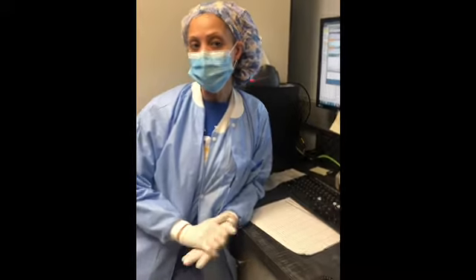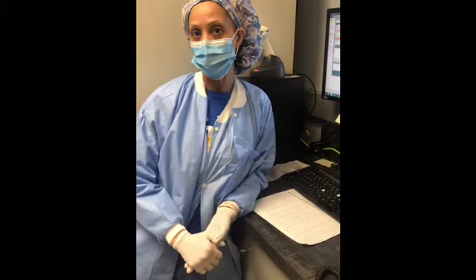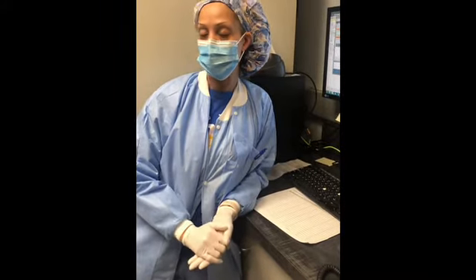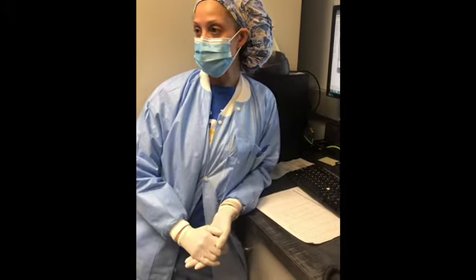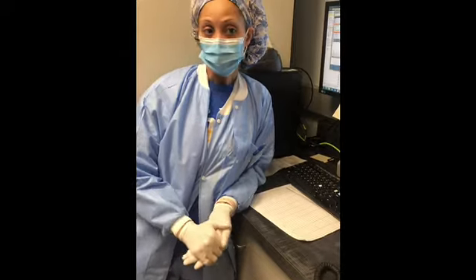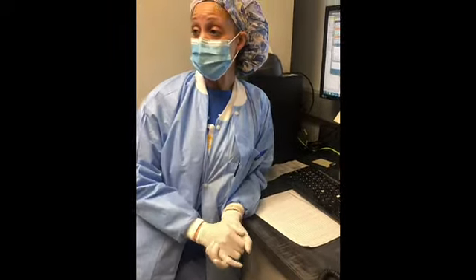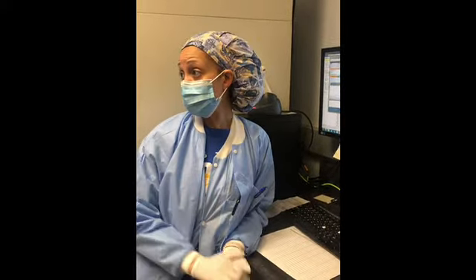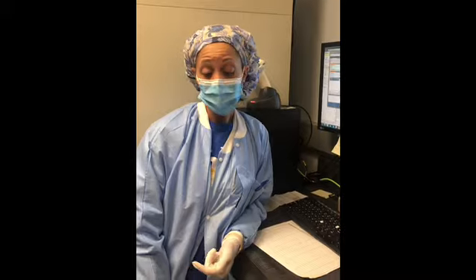I know it's a lot, but that's just kind of the nature of the department itself. You know, you have to kind of do those justifications and investigations when you have ABO discrepancies like that to try to solve. And sometimes it could be due to rouleaux. You can have rouleaux in your forward sometimes as well as your reverse too. Okay. And you could have a positive ABO discrepancy due to a cold.